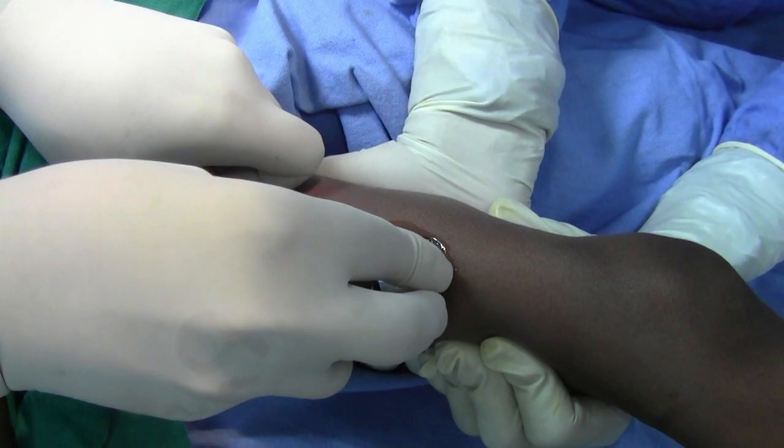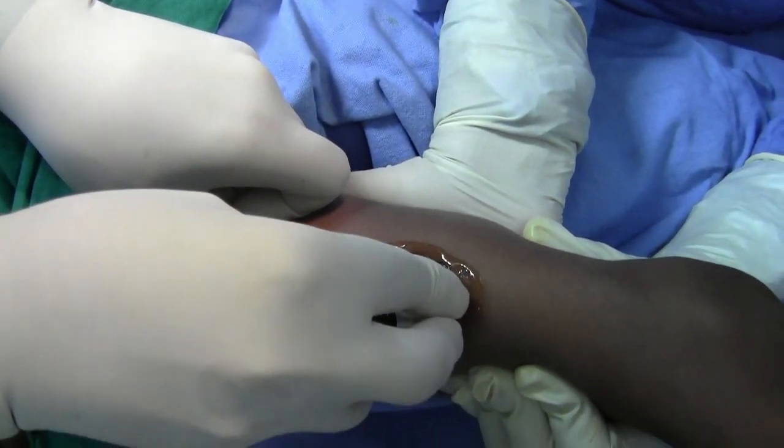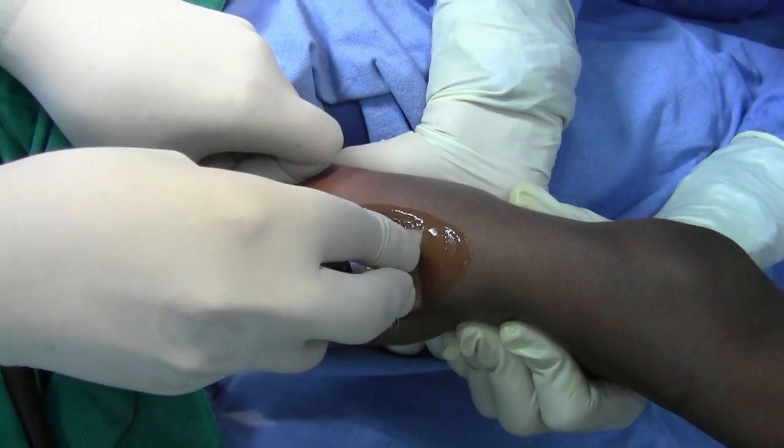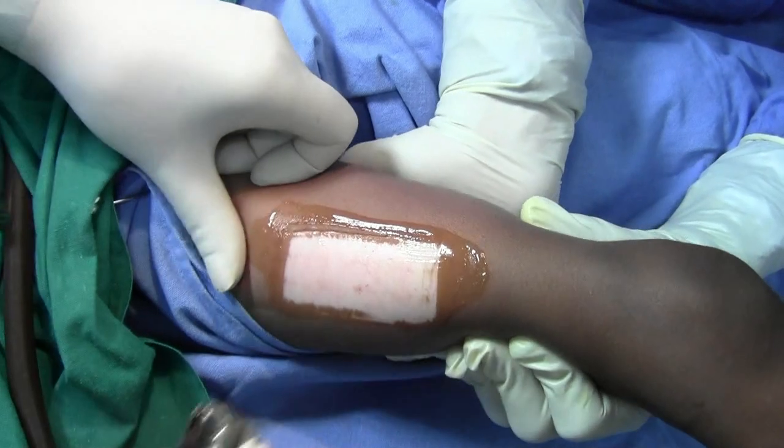And then drag the dermatome — see. It's complete.